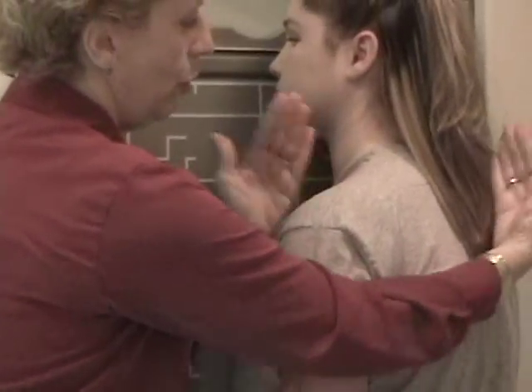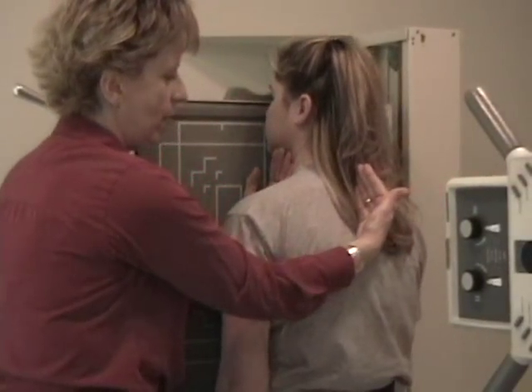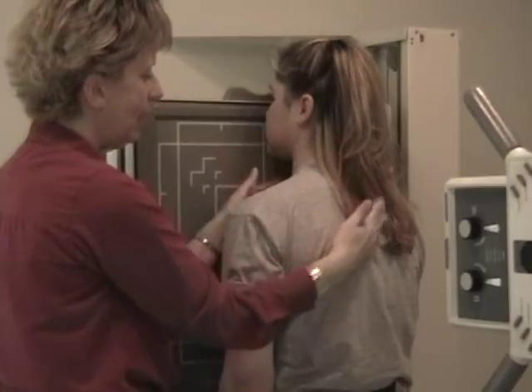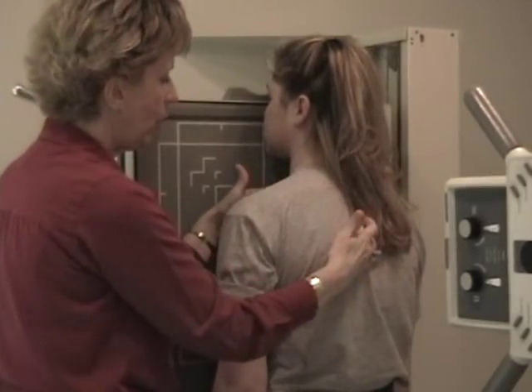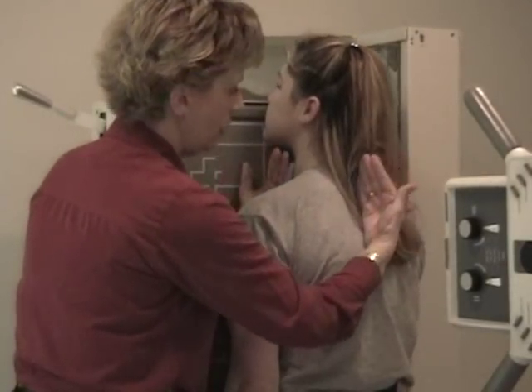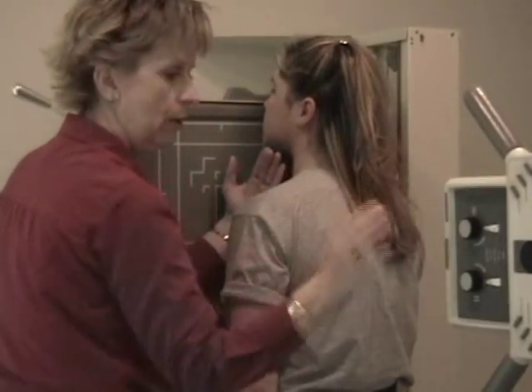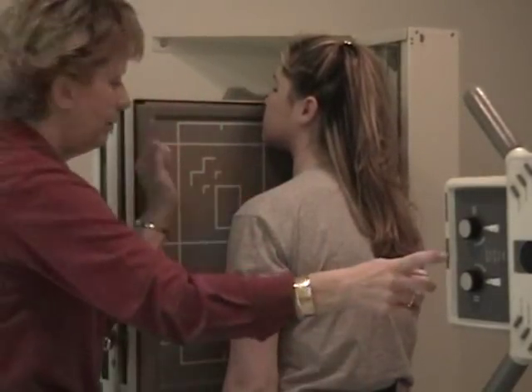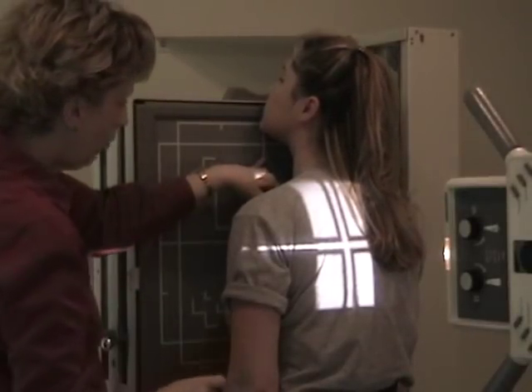If she's steep, notice how my hands go further apart. If she's shallow, notice how my hands will become more aligned, and I barely want that sternum to clear the spine, so I want a shallow oblique, and I'm just looking at the patient here and separating the sternum from the spine.